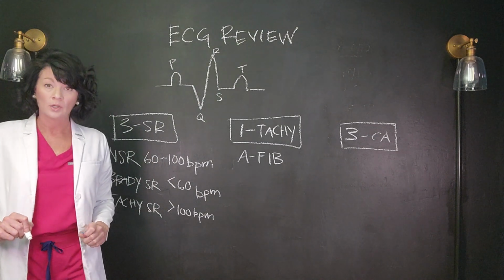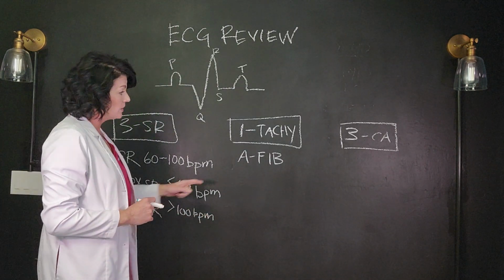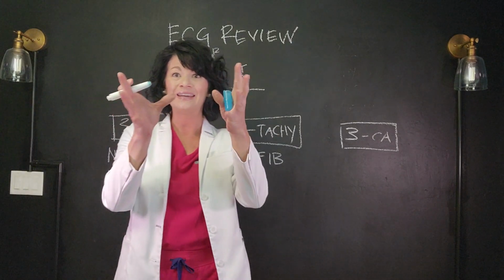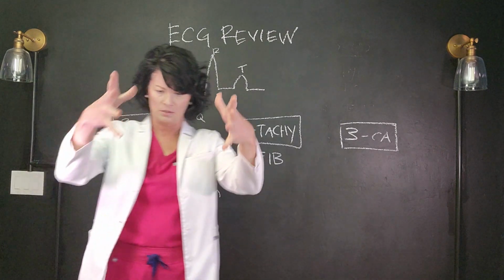It is very common, right? A lot of our cardiovascular disorders result in potentially Afib. Now, what is happening with Afib is the atria are not contracting, they're quivering. Okay, so think about that from a physiological standpoint, right?